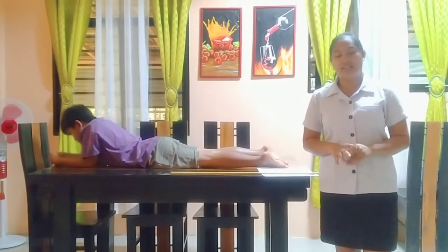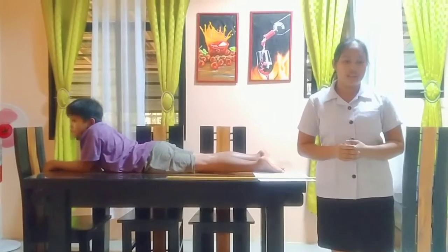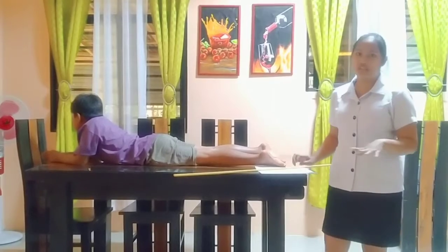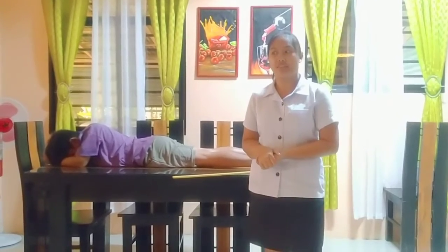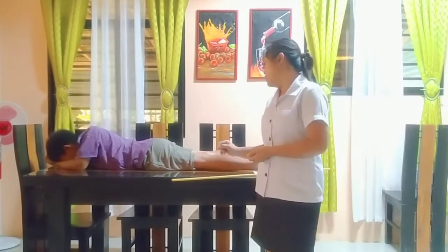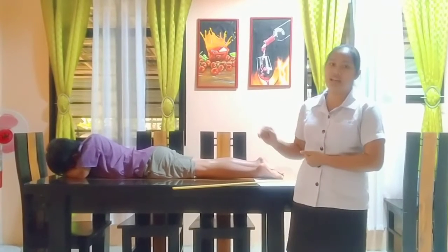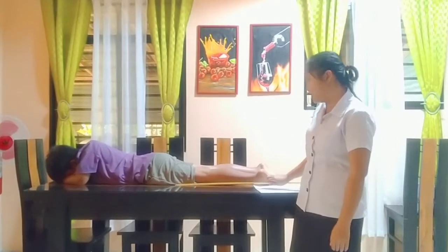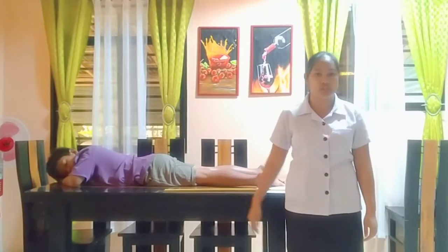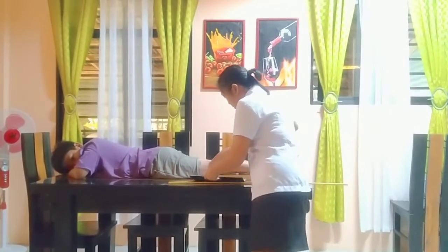Next projection will be the tangential Hughston method. Do not do this if the patient has a suspected transverse fracture. So, ang dinedemonstrate po ng projection na to is only vertical fractures. So, instruct the patient to be in prone position. And lagay po natin ito sa below.